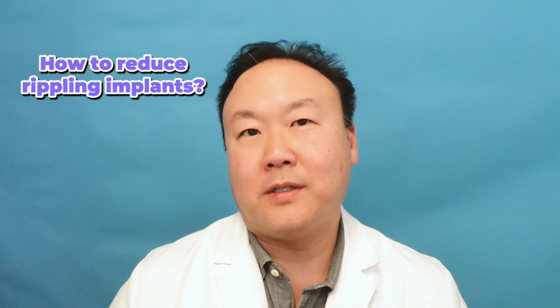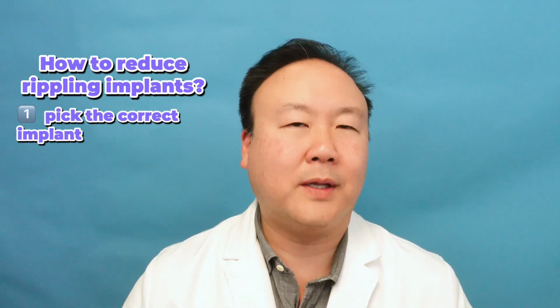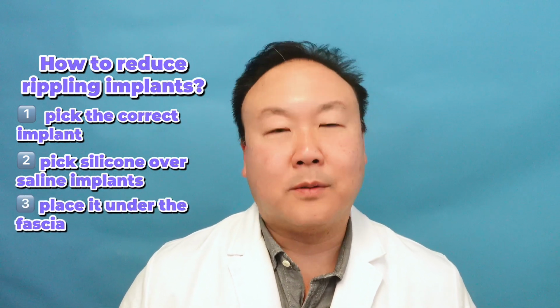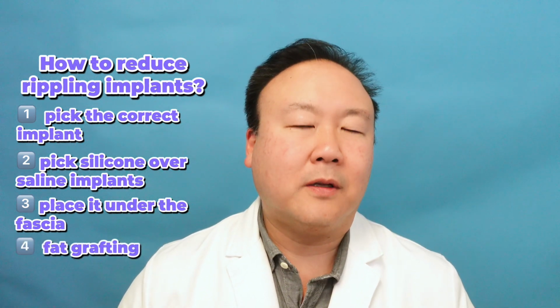There are a bunch of ways to help reduce this, including making sure you pick the correct implants, the implants that I think are slightly overfilled, pick silicone implants over saline, place them underneath the fascia as opposed to above the fascia, and we can actually do fat grafting. There are a couple other things or considerations regarding rippling and wrinkling, but those are the major ones, and that's something that can be eliminated or made to look better even before you have your operation.